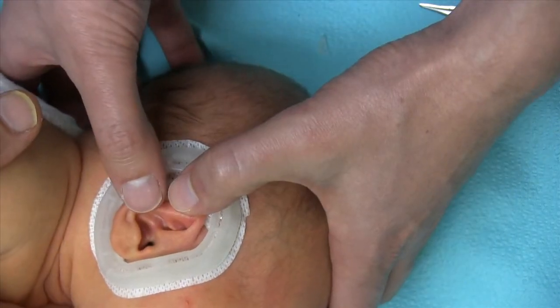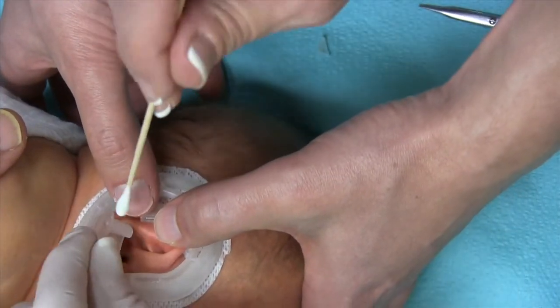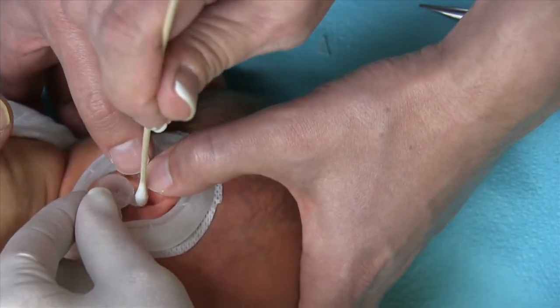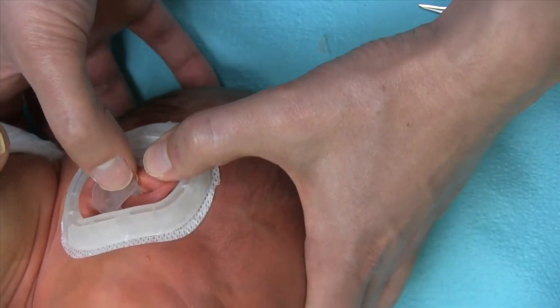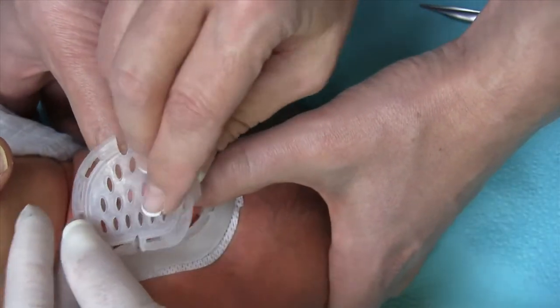This is the conchal former that's going to push down this conchal crus. You just want to make sure that you slide it right in here — you don't want it on top of this, you want to slide it inside. Once it's adequately positioned, we can put the lid on top and hold everything together.